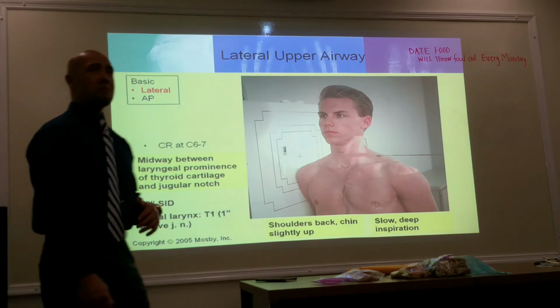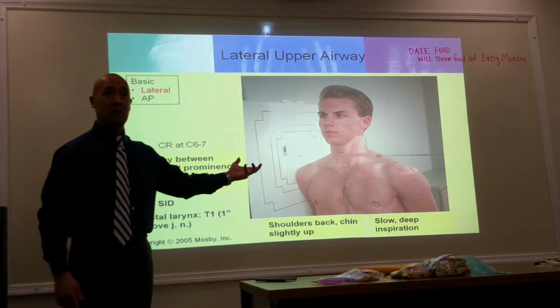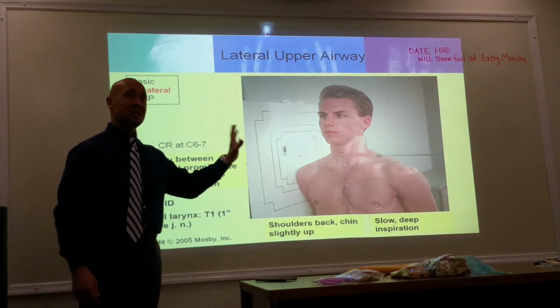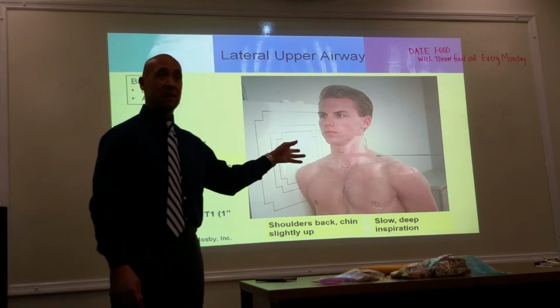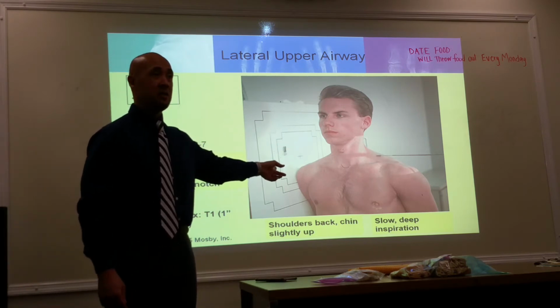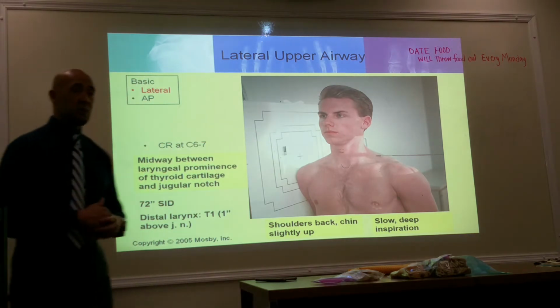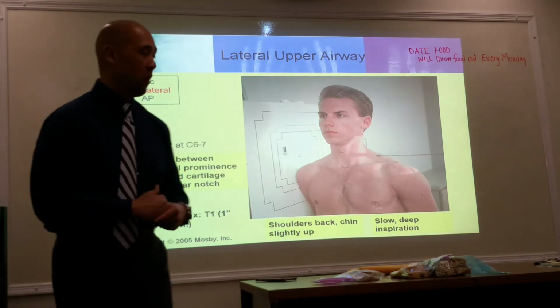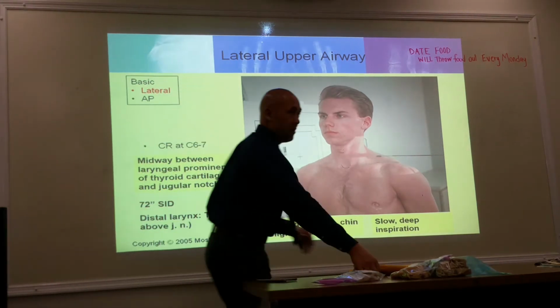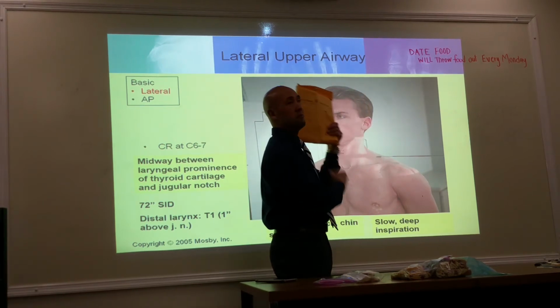With the lateral, it doesn't matter which way. You can do left lateral, you can do right lateral. But since we're used to doing things in a left lateral orientation, it's probably best to go ahead and do it in a left lateral. Which position is this? Right lateral. You're going to use a small image receptor, and I'll open up your field to about 10 by 12 lengthwise.